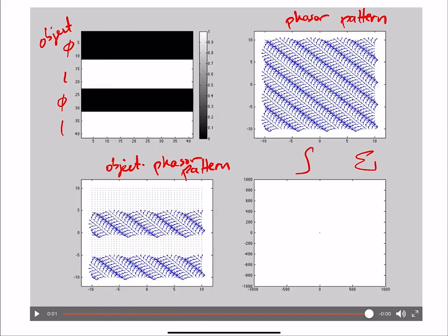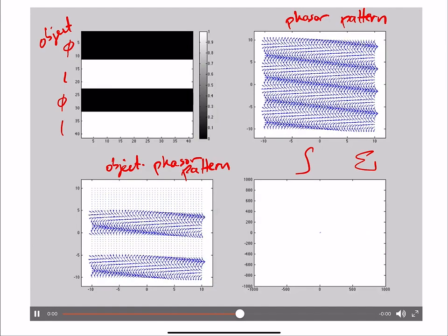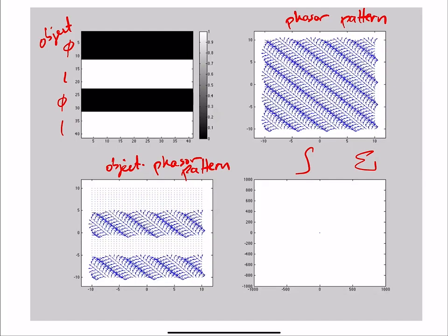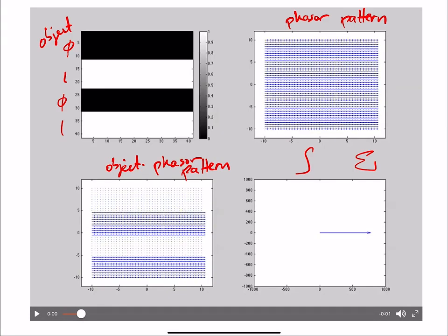Okay. So if you look at the phasor pattern, you notice we're going through different parts in Fourier space. Okay. So we're sort of imposing some spins, some patterns. Let me see if I can do it very slowly now. Okay, so basically at the center of K-space, when all the spins are fairly aligned, the summation is pretty big.